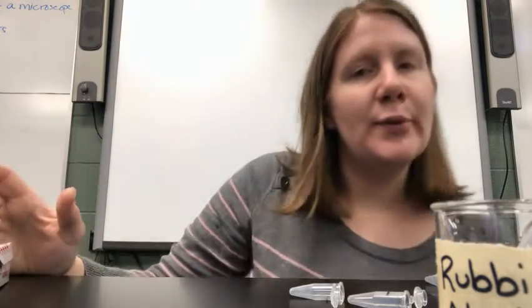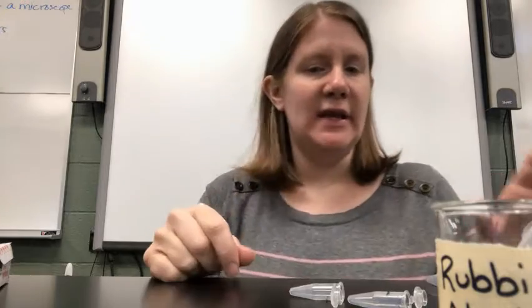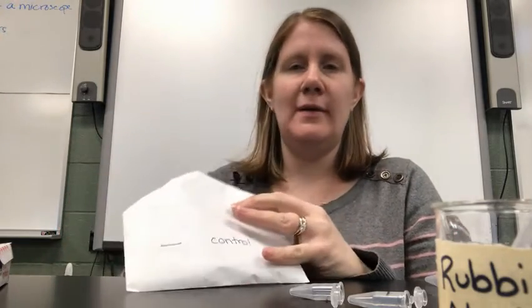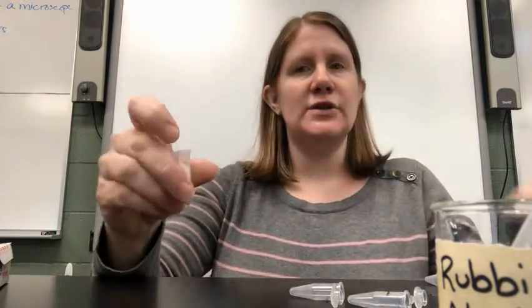So I'm going to go through and perform this little lab activity for you today. I'm going to start with my negative control. So I'll take that envelope. I'm going to open up the envelope, and in there should be a vial.